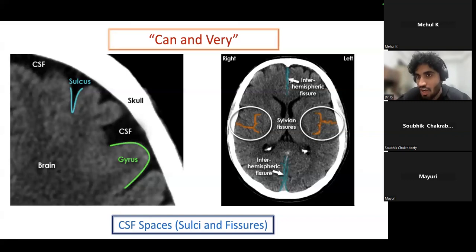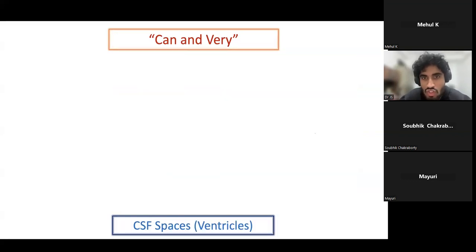I also learned a lot, that there can be an SH and other things as well. The Broca's aphasia was not because of the interhemispheric bleed, but because the patient had some other lesion as well. So the patient can present with just a symptom of aphasia and can have an SH as well. That patient had an interhemispheric SH with other lesions in the lateral, frontal and other regions. That is one thing you should appreciate.